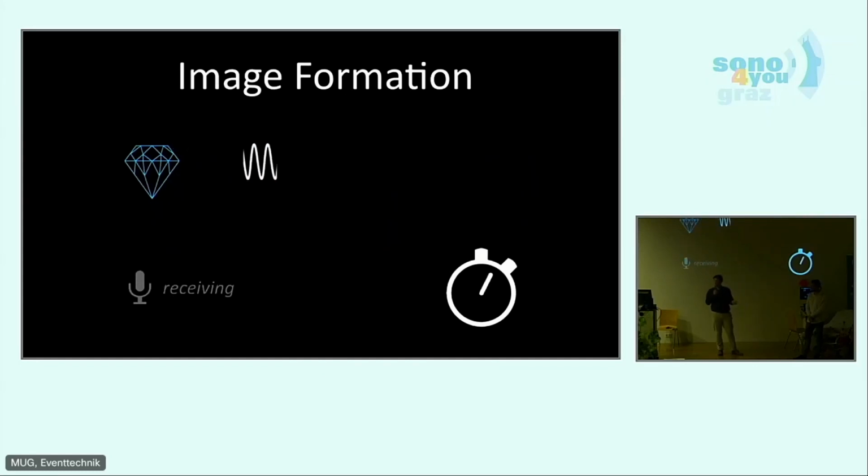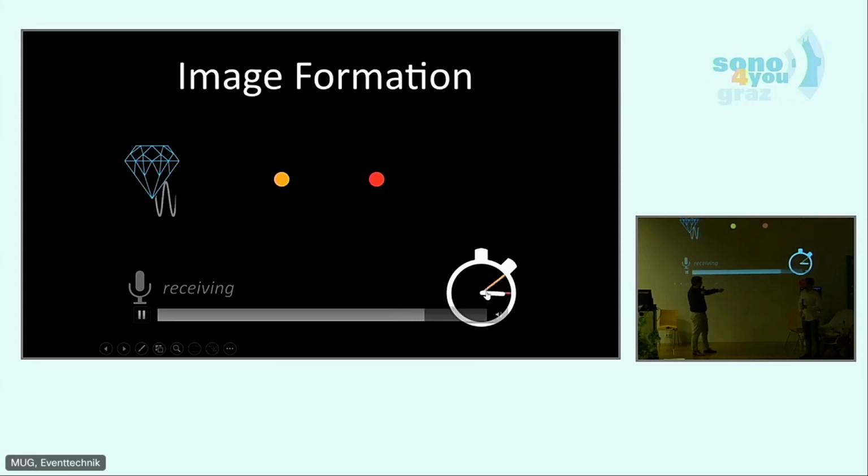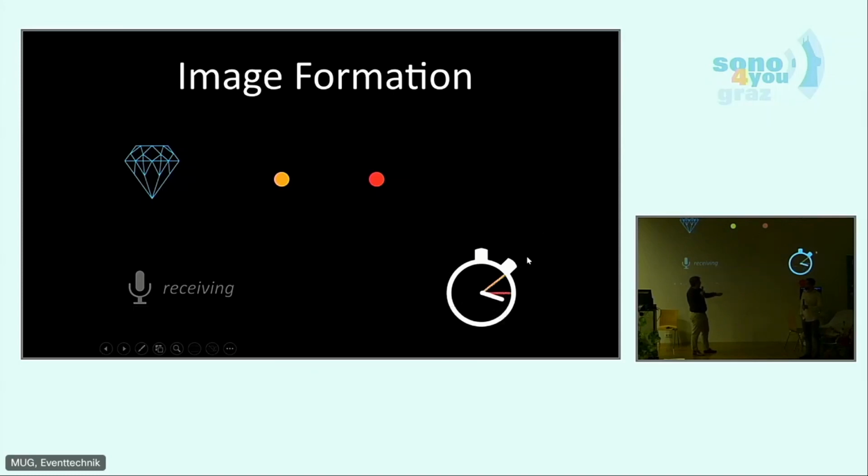And here comes the stopwatch. When the ultrasound beam is emitted, the machine just starts a stopwatch and is counting the seconds. But now, when we hit a structure in the depth with our sound beam, there's an echo happening because you already know there's an impedance step happening. And now our machine tells us how long it took when the echo was coming in. So now we know how deep the structure is located inside of the tissue.